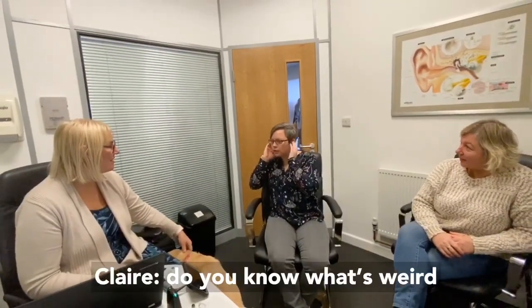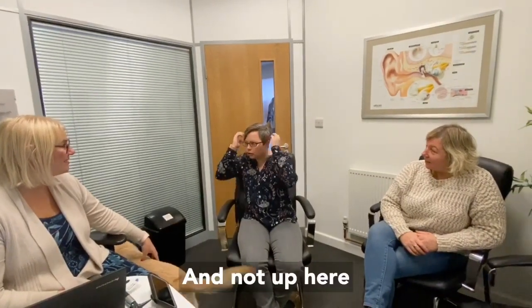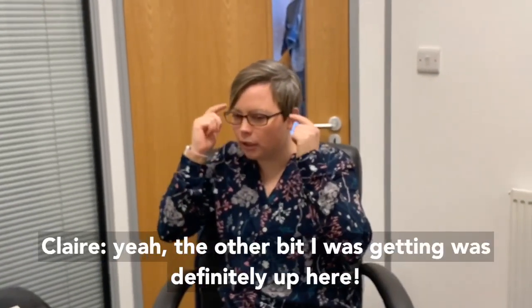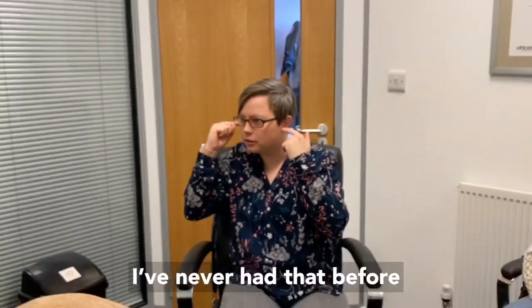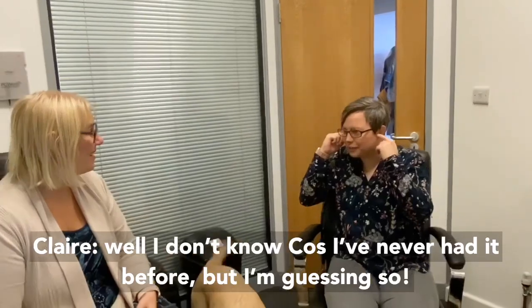Do you know what's weird is I can hear in my ear, not up here. Yeah. That's because of the receiver. The other bit I was getting was definitely up here. Mm-hmm. Whereas now it feels like I can hear in my ears. So it's never been like that before, naturally hearing. Well, I don't know, I've never had it, but I'm guessing so.